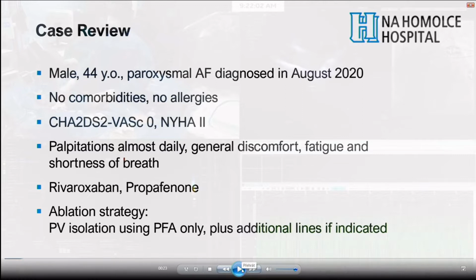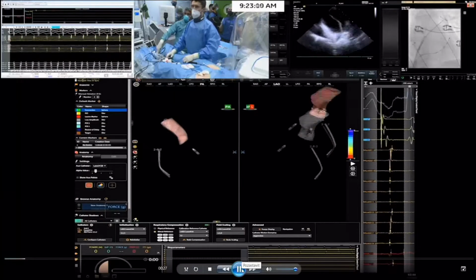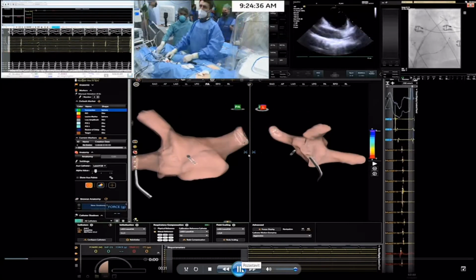The ablation strategy is to use PFA only, no other lesions with RF. So only PFA focal catheter, focal lesions. This is starting at 9:23. This is on the top, you can see the actual timing.